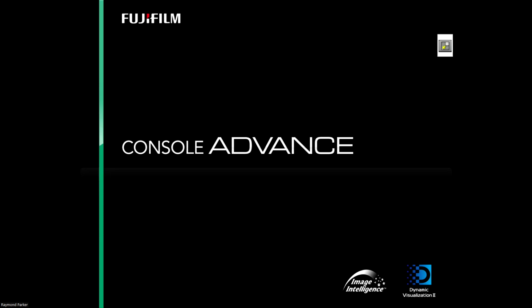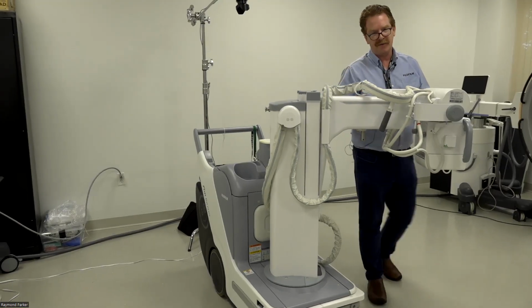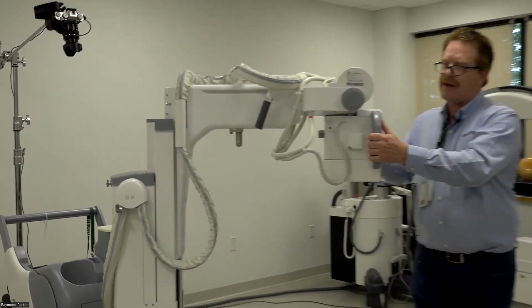So while this is booting up, I want to move towards showing you some of the features of the actual portable itself. Move it around a little bit, give you a pretty good view.